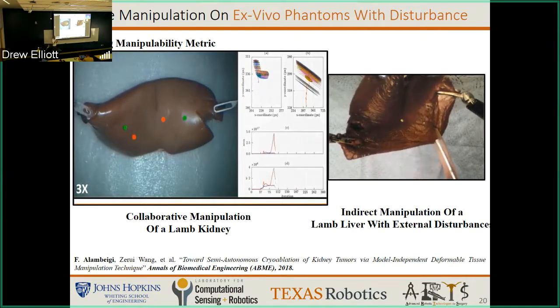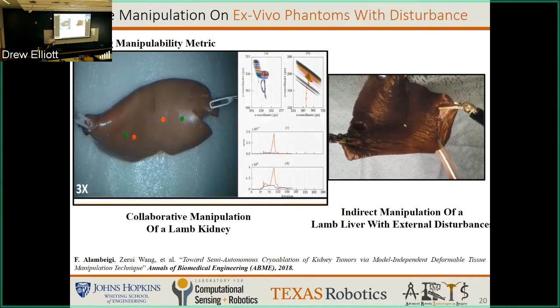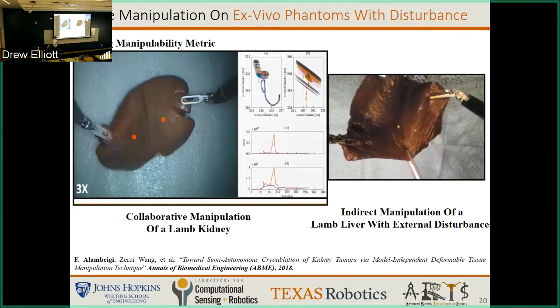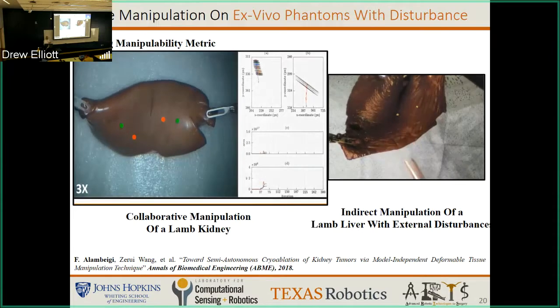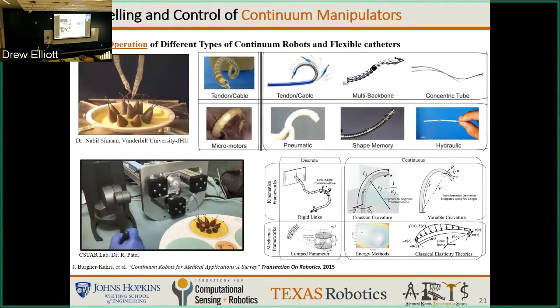Because the Jacobian, as I said, we are iteratively learning, and for this tissue, as soon as you touch it, the deformation locally changes. So the algorithm should capture that change in the elasticity and deformation model, and we showed that it's working very nicely. I said the deformable object can be a tissue and a robot.